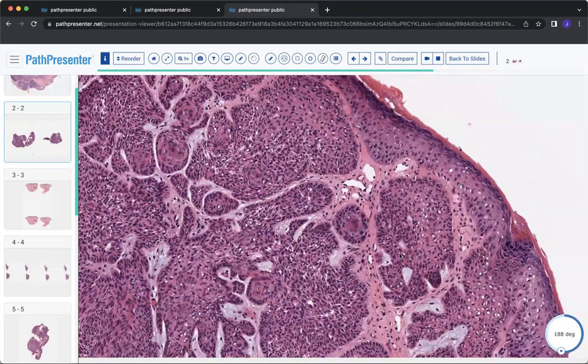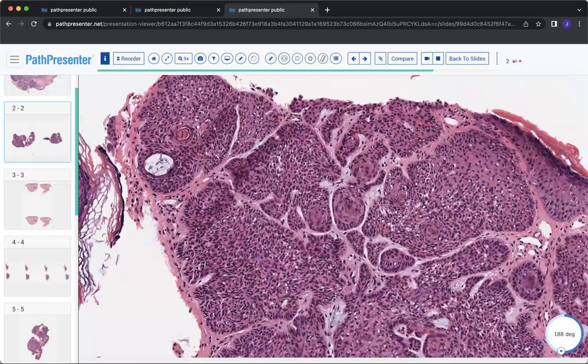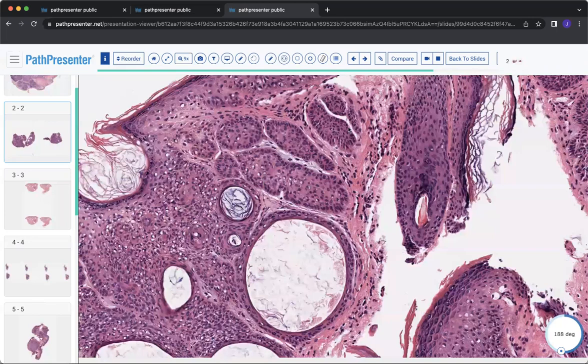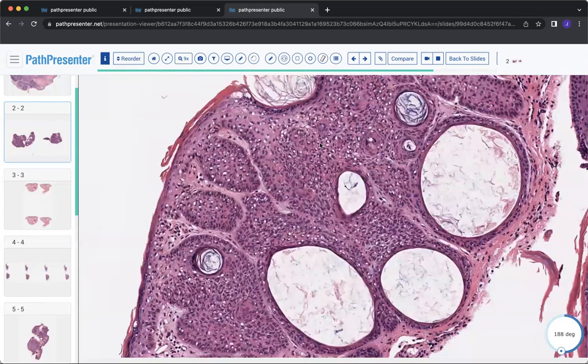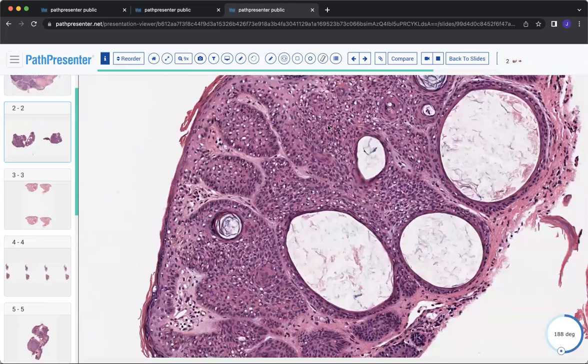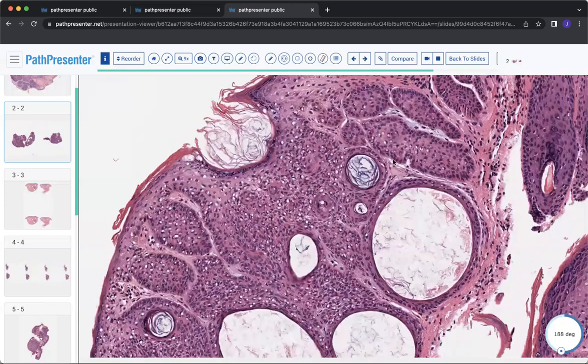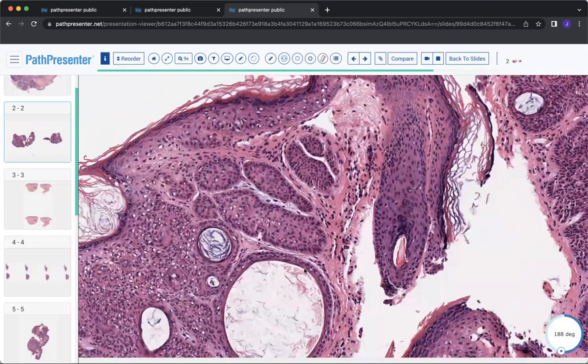It's not as blue as many basal cells. You might find some areas that are looking like they're actually turning into a hair follicle more, where you're getting this almost like a matrix-like formation or follicular formation developing into a small island, these so-called papillary mesenchymal bodies.